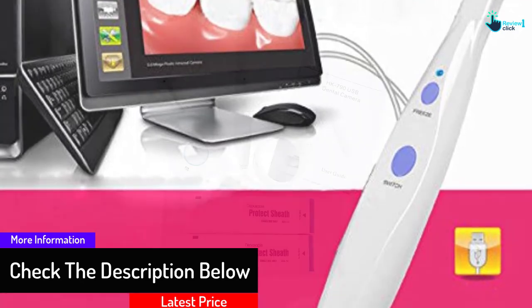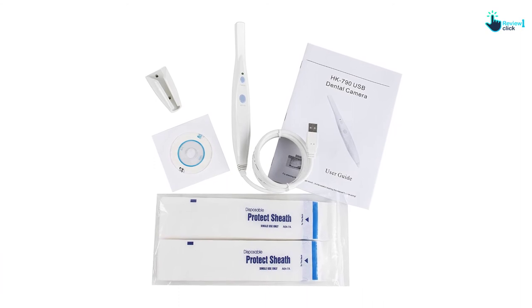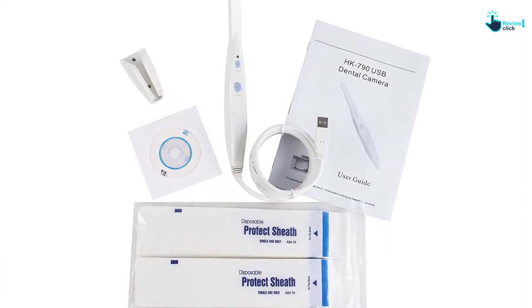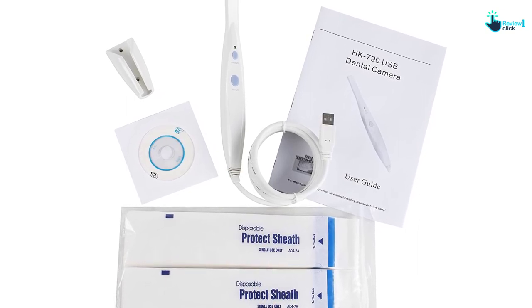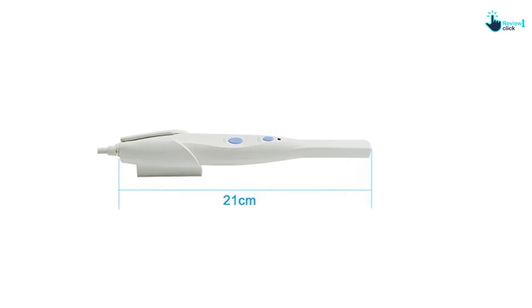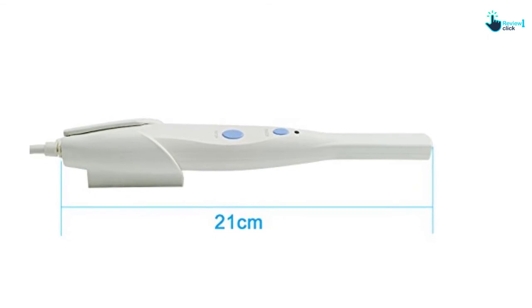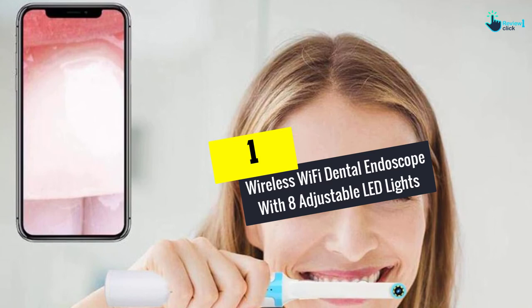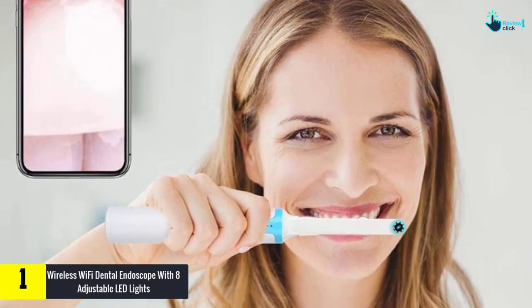It has an open code that is compatible with different types of clinical management software. It can record video and allows you to easily show patients the condition of their teeth to assist with dental care. You can easily adjust the focus and it comes with dual capture buttons.